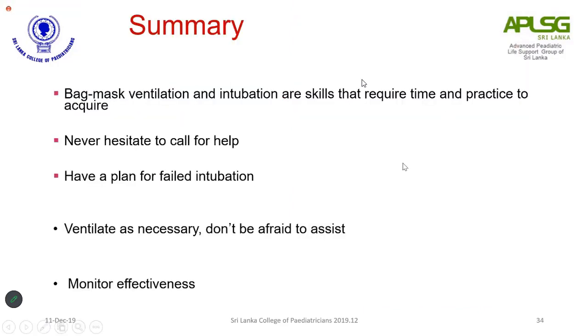So in summary of airway management in children, bag and mask ventilation and intubation are the most important skills that you need to learn, but these skills require time and practice to master. And please never hesitate to call for help, even though you might be the most senior person in the unit at that moment. If you are not sure whether you can intubate, please never hesitate to call for help.